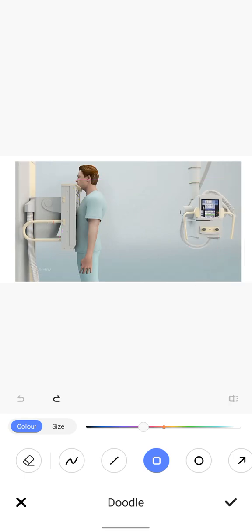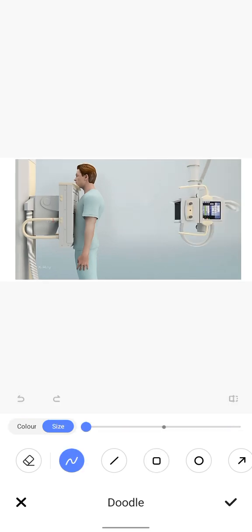What we will do first, we will flip this side of the X-ray tube towards the patient. Now I flip the window side of the X-ray tube towards the patient. Now when I expose, the X-rays will come out of this area.